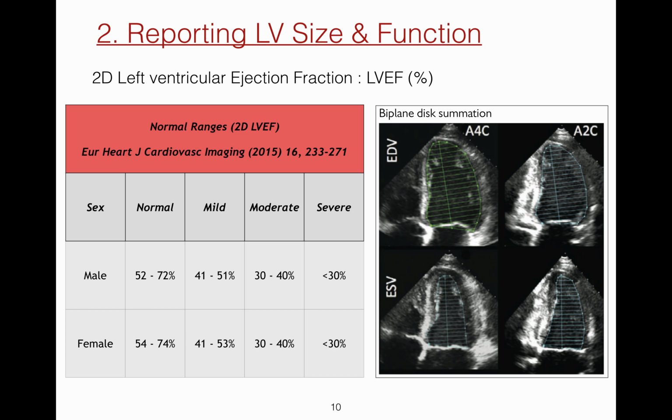As you know, to ensure the most accurate ejection fraction measurement by 2D, you should aim to optimize your 2D image, reduce the depth displayed to ensure a more accurate tracing, avoid image foreshortening, trace the compacted myocardium, excluding the papillary muscles, and ensure that the line at the level of the mitral annulus is close to horizontal.